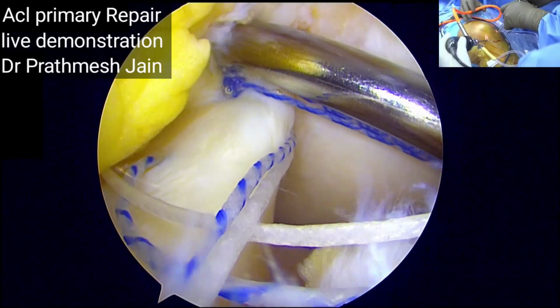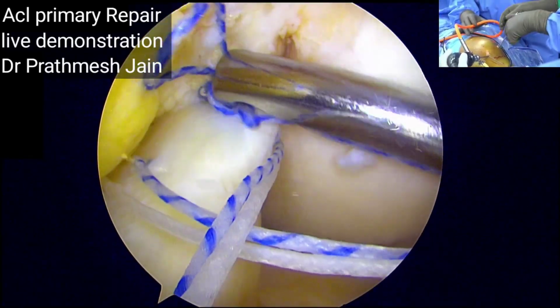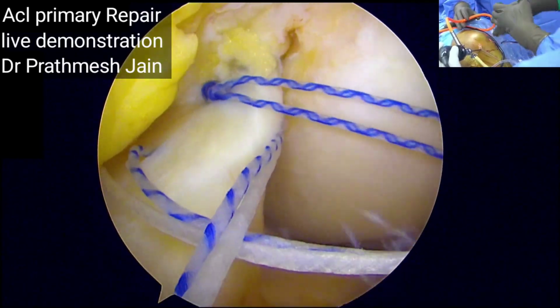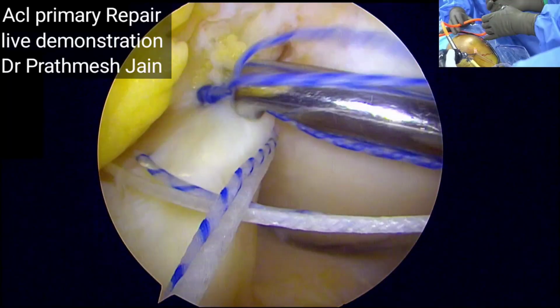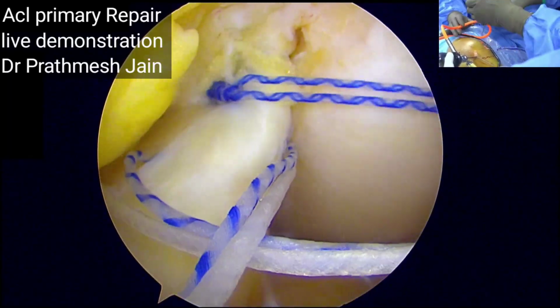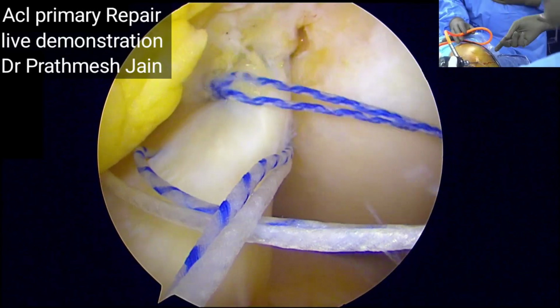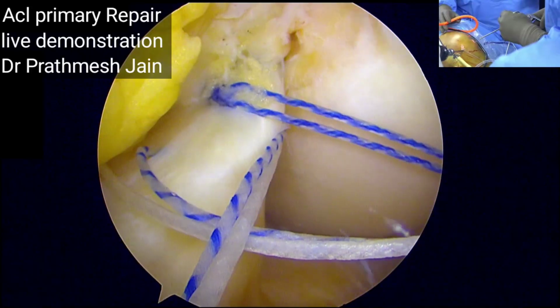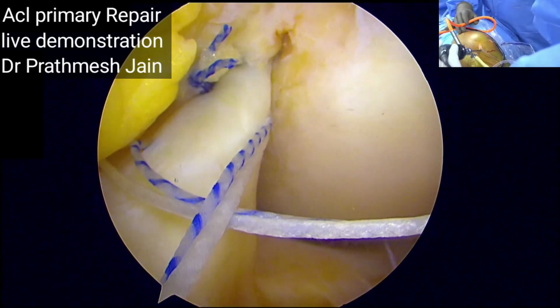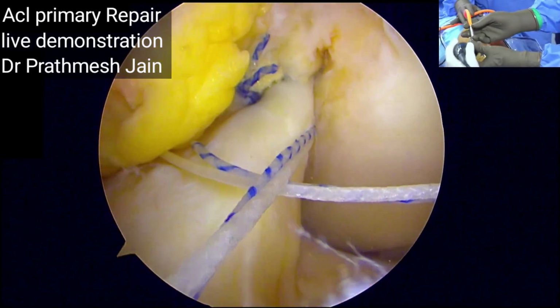The repair is very good, and nowadays in ACL primary repairs, the recommendation of suture bracing or internal bracing is also not that strong. You can achieve good results without internal bracing also. So natural healing is paramount, and what we are trying to achieve here is the best possible natural healing by use of all the natural methods without using a lot of artificial material.